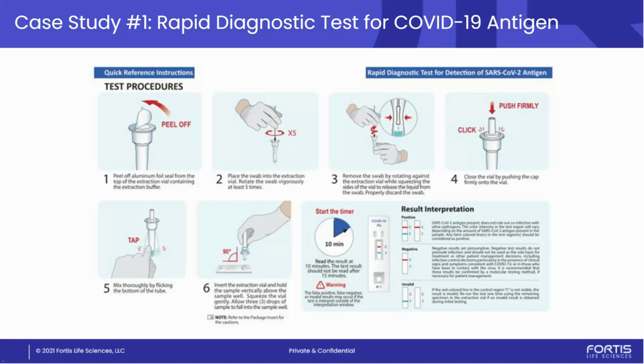the test strips themselves can be fully automated. They assemble the cassette, fully automated, and then they made a buffer tube that's automated, and then just the consumable in terms of the swab that's purchased sterile and added to the kit.